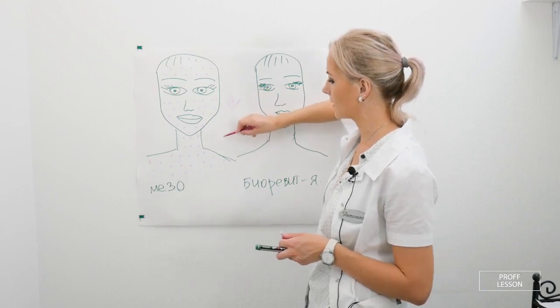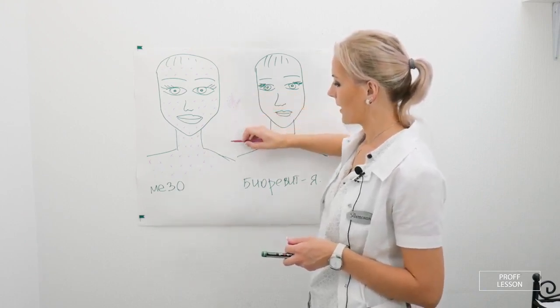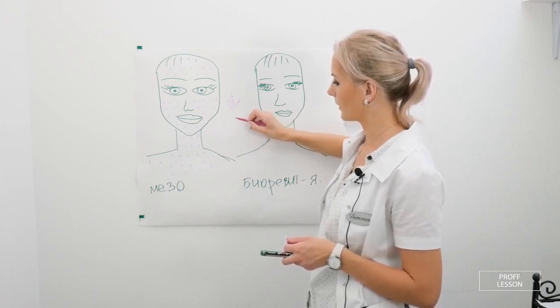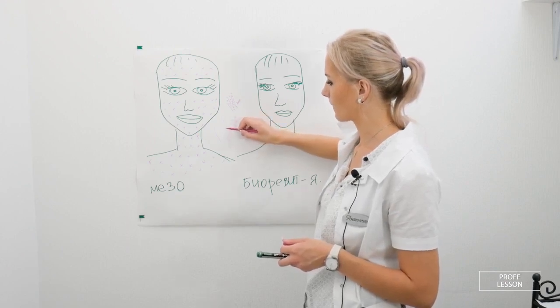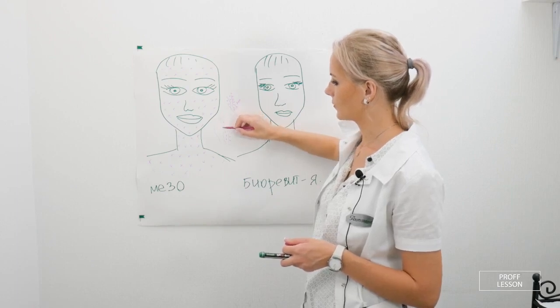If there are veins on the legs, accordingly, it is exactly the same: 5 to 10 millimeters between the papules. And along each vein, we inject the drug. It's usually vitamin C or some kind of ready-made vasoconstrictor cocktail.